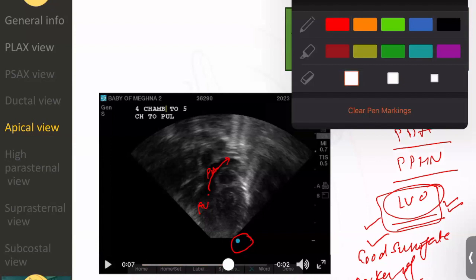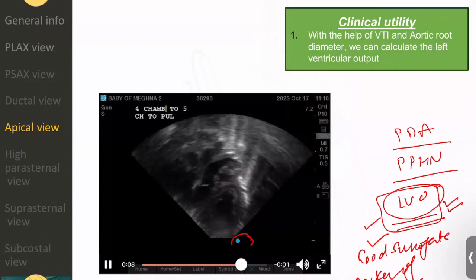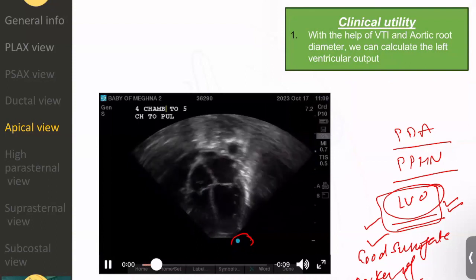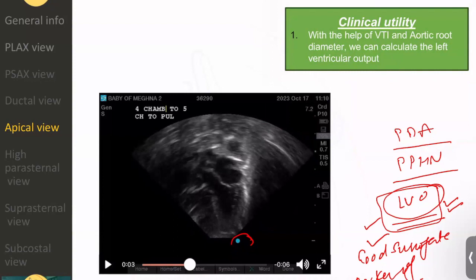Okay. So we go to our principal thing. What we wanted to show here is which is the point where we need to measure it. Okay, so this is the point. When we see that the aorta is opening up very well, we have to measure the output here. To measure the output, we will use Doppler. Remember the first presentation: if we want to see how fast the blood is going, that velocity is estimated by the Doppler.